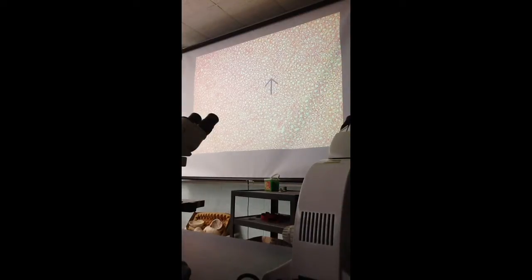Let us look at this field. Are you able to see any of those structures here? No. So you are in the medulla. What you are looking at is the cross section taken through the medulla. You take one medullary pyramid. You have been looking at the longitudinal sections until now.